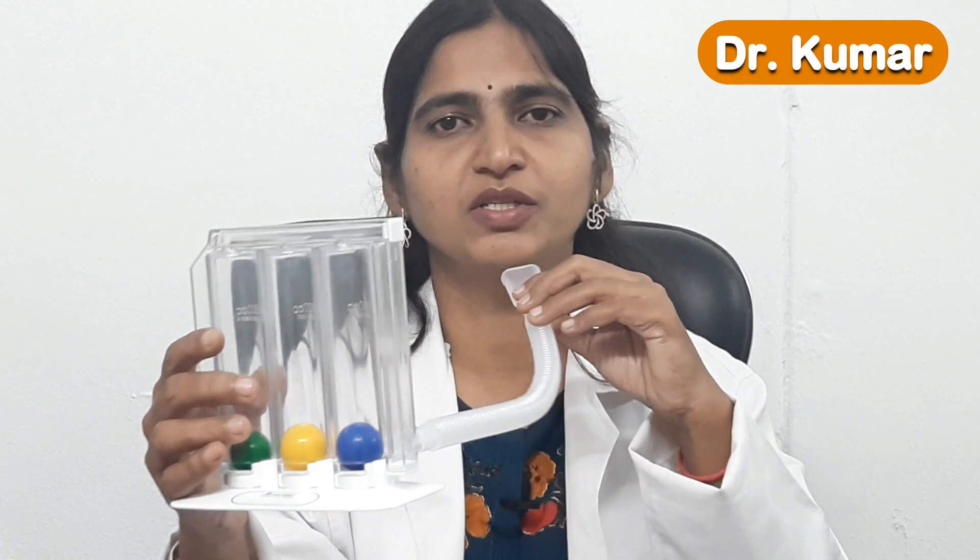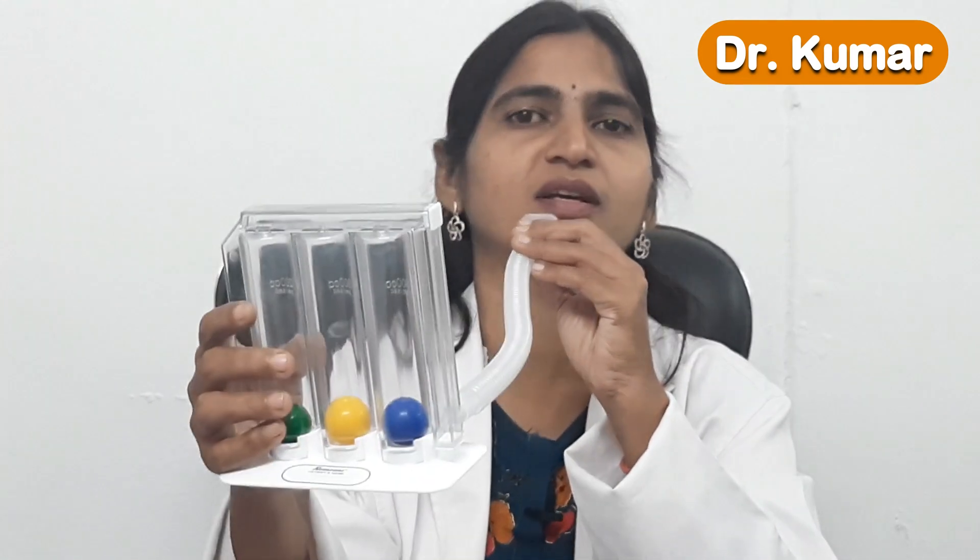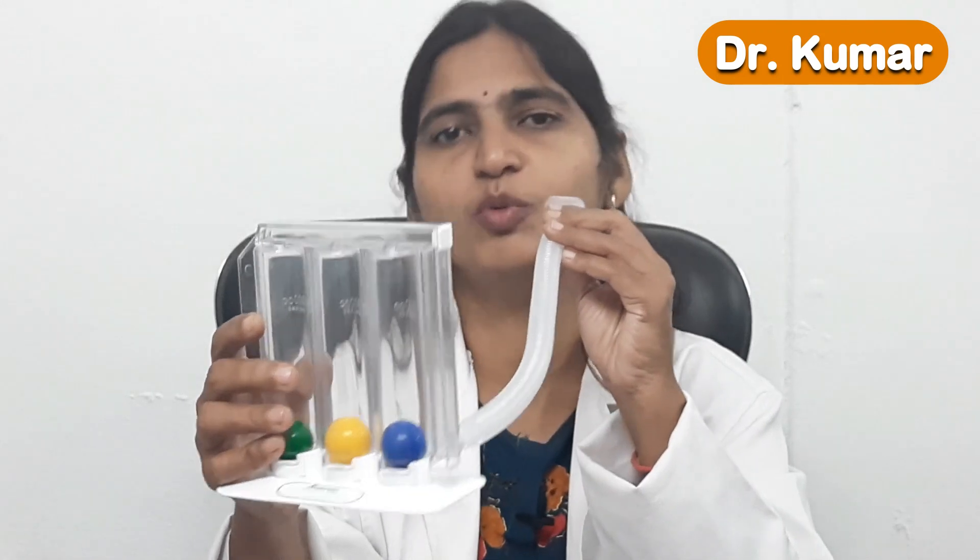To use this device, the person should sit upright and place the mouthpiece into the mouth. Importantly, they should hold the spirometer at mouth level — not in a downward or upward position — as that will affect the breathing effort and the movement of the balls.